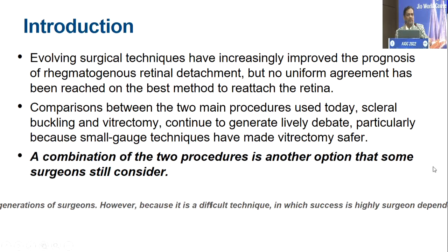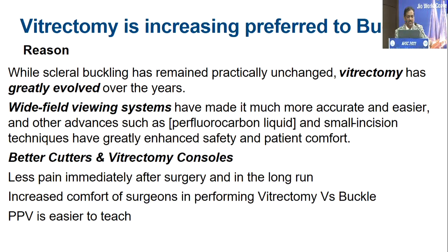So I got the job of comparing both, and we love both the procedures, and unfortunately with the evolution of vitreoretinal techniques that are coming through, we are finding that people are tending to go more and more towards vitreous surgery than scleral buckle. And today, if you compare both the procedures, it will always be a debatable thing, because we are coming from a generation which started only with buckles and then slowly moved on to vitreous surgery, versus people who started with vitreous surgery and try to move to scleral buckle, which is always going to be a difficult challenge. But many a times, rather than pitting both against each other, it is always good if we can have a combination of the two procedures in many of such cases, and that can give us fantastic results.